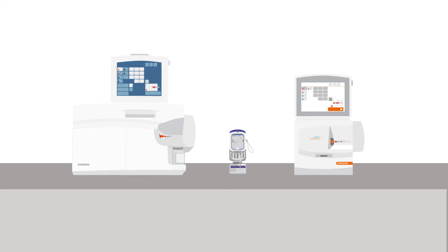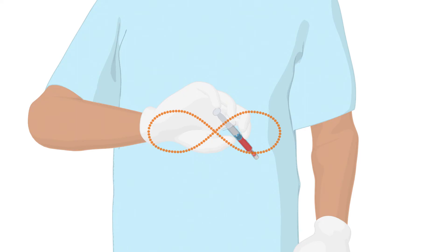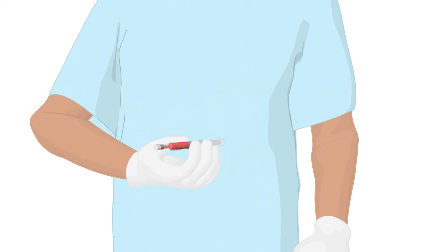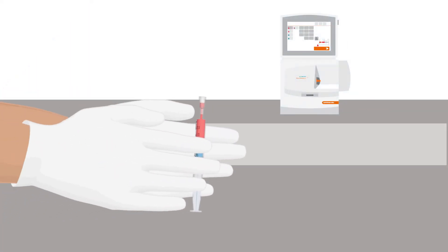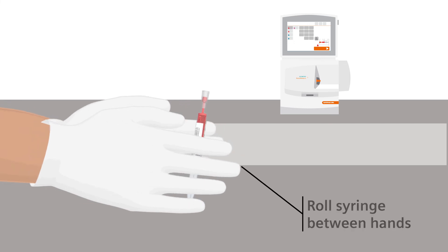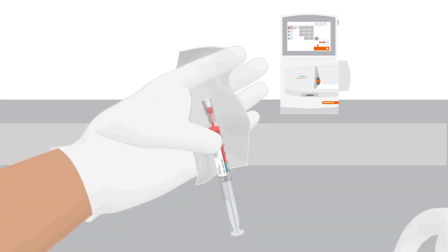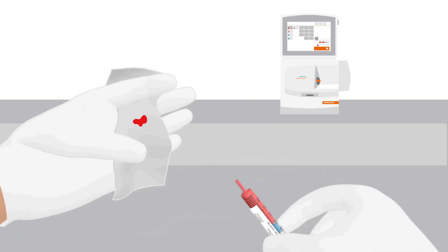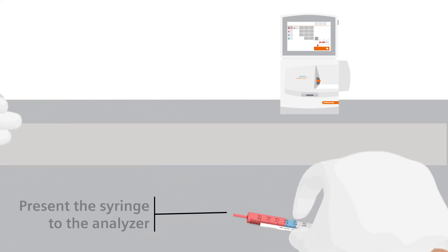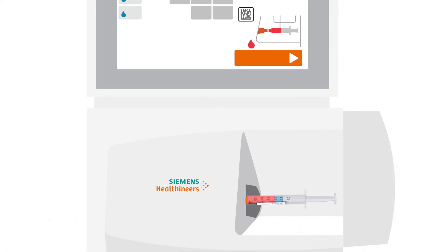Follow a two-step mixing process: first by rotating your wrist back and forth, and then rolling the syringe between your hands about 10 times. Remove the cap from the syringe and expel the first few drops of blood into a gauze pad. Present the sample to the analyzer and start analysis.